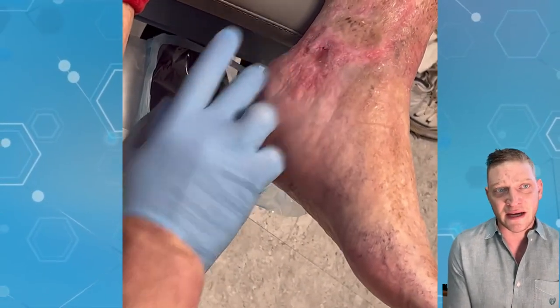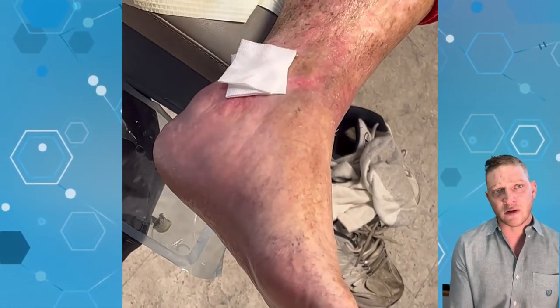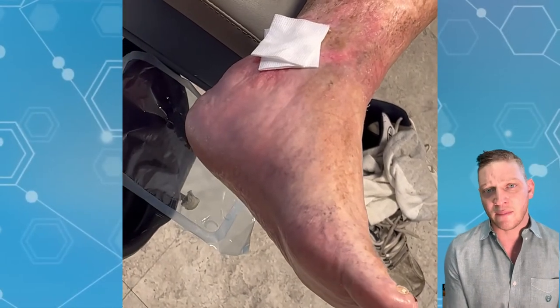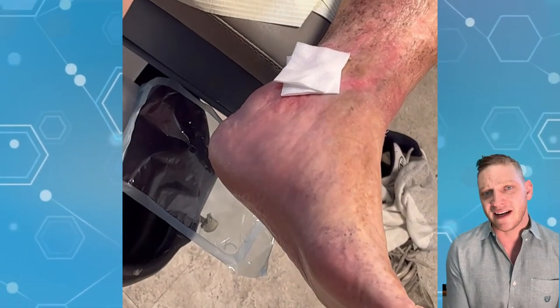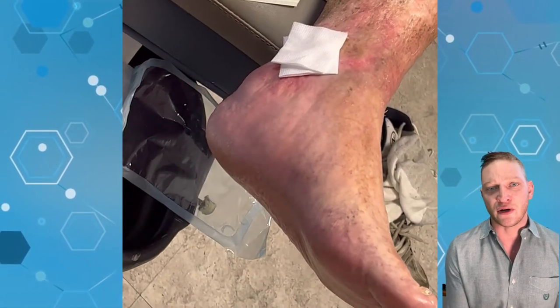This guy's had this thing for years — it used to be seven centimeters big; it's taken us about two years to get it this small. When it stalled around this time, we had sent him over to a friend of mine, Dr. Guja, who did the vein seal — venous seal — procedure on him, which pretty much is medical-grade superglue gluing the superficial veins in the leg closed.